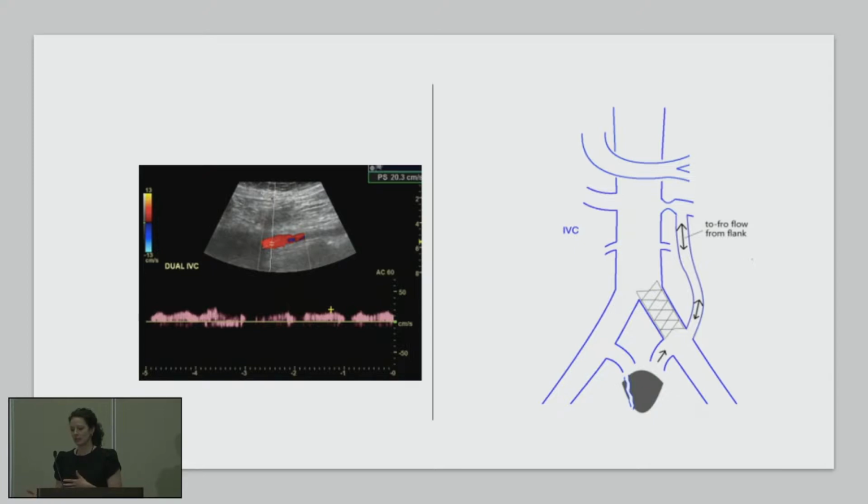This patient in particular, she was very confusing because she not only had a duplicated IVC that I called a gonadal, but it was also retrograde filling. So it checked every single box, but it was a duplicated IVC. So take the extra 2 minutes and identify branches from that gonadal vein. That'll tell you the difference between a duplicated or truly gonadal.